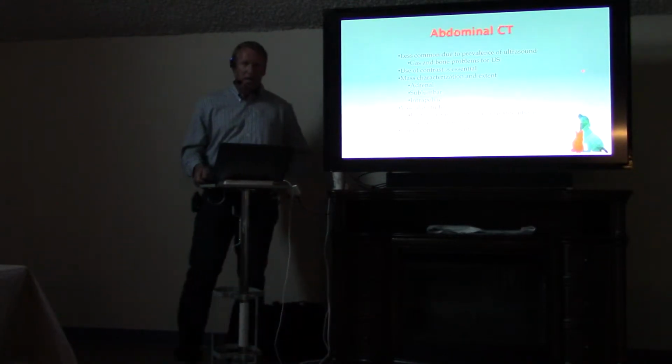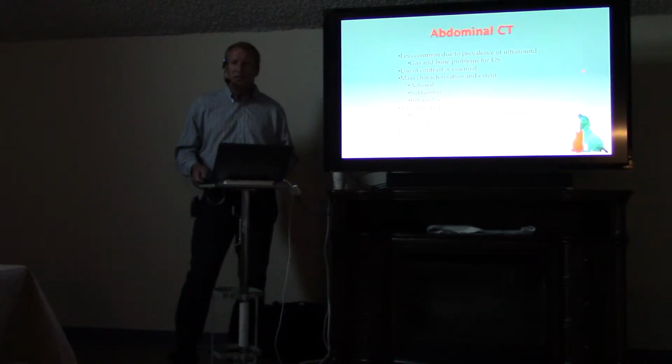I don't do a lot of abdominal CTs, and that's largely because of the prevalence of ultrasound exam. However, sometimes gas in the GI tract or bony structures can inhibit what we're trying to look at on an ultrasound exam.